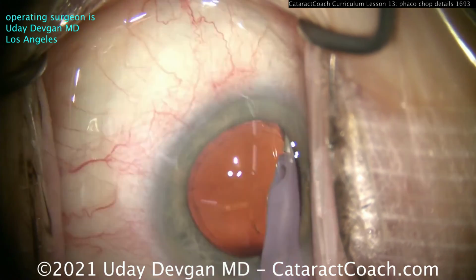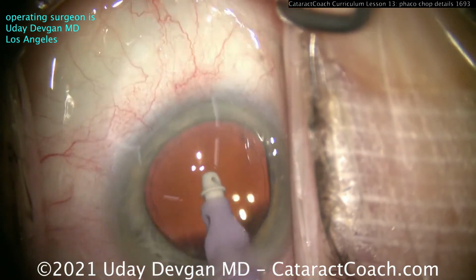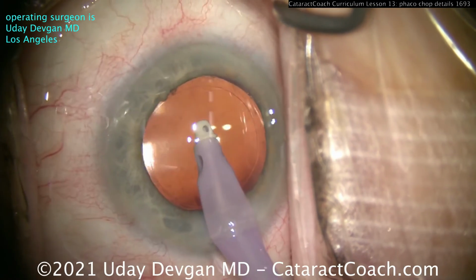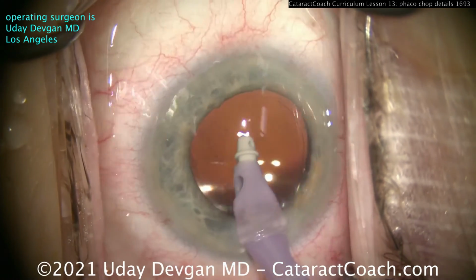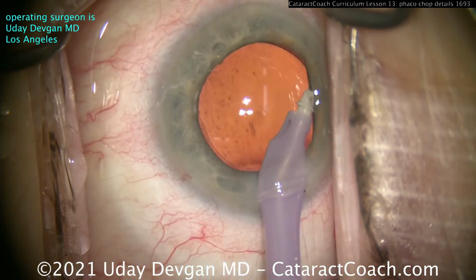And then cleaning up here under the surface of the anterior capsular rim, just to get some of that lens epithelial cell material off that area. That'll decrease the inflammatory load as well. If you inadvertently grab the iris like that, just let go. You'll be fine. So you can see the Purkinje images.